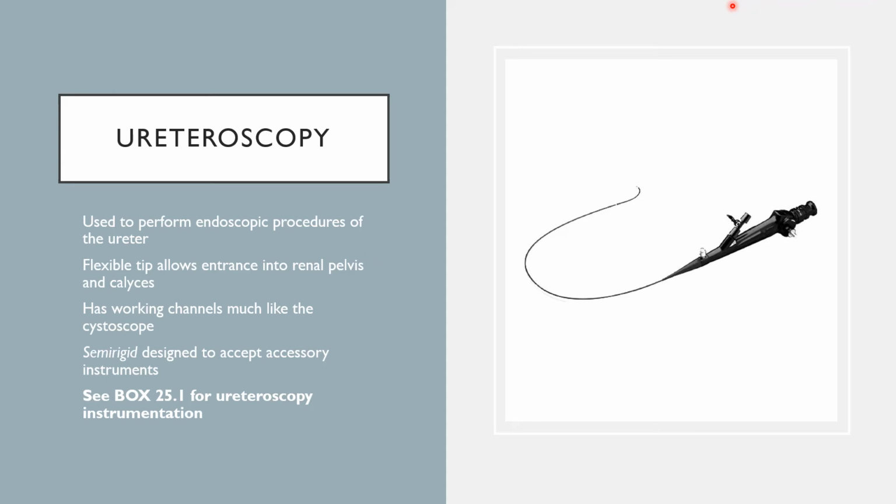And then as I said before, the percutaneous nephroscopy, that's when that patient would be in prone position. That camera looks a little bit different. It's got a 45 or 90 degree offset eyepiece, and it's operated using standard endoscopy equipment: our camera, our light source, a monitor for visualization. And it's usually, as I said, performed with that patient in the prone position.